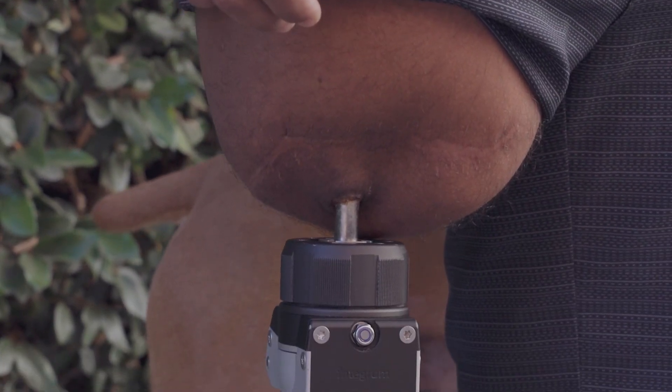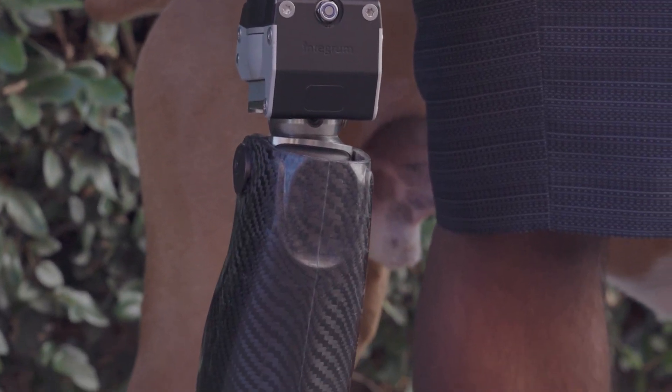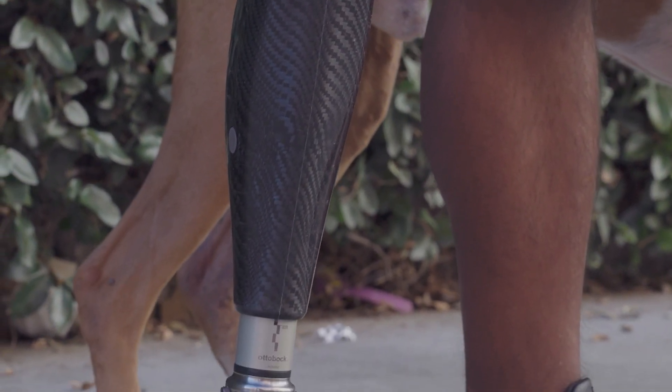So let's back it up for a moment. Osseointegration refers to the ability of human bone to fuse with metal, specifically with titanium. And as you can see with this image, the fusion is solid down to the microscopic level.